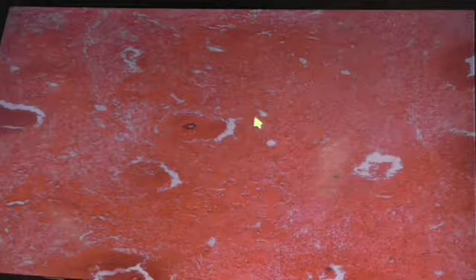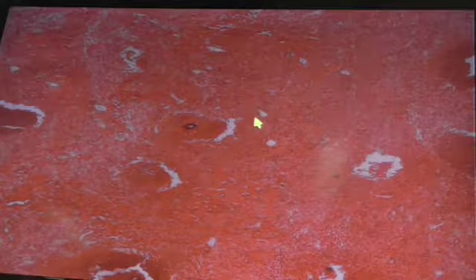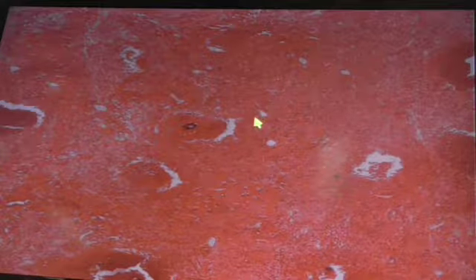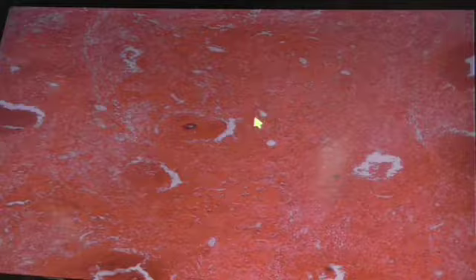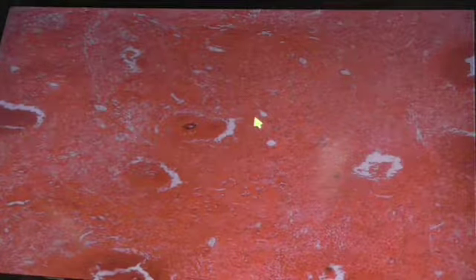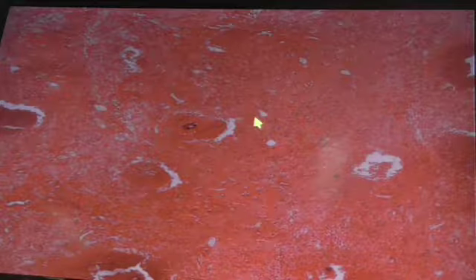And then the fact that you got these yellowish clumps that exuded, well, these bacteria are notorious for producing what we call sulfur granules. Sulfur, S-U-L-F-U-R granules. Okay, so these clumps are really just colonies of bacteria, notoriously Actinomyces. Nocardia is a bacteria that can kind of resemble Actinomyces. It's also a bacterial agent, but in this case, Actinomyces bovis is the agent.